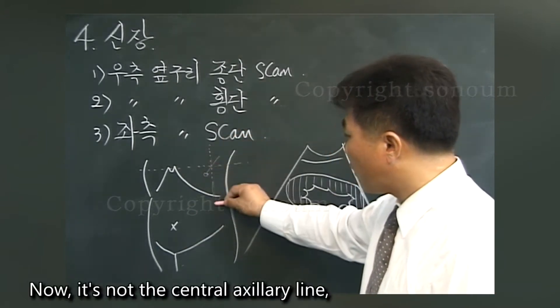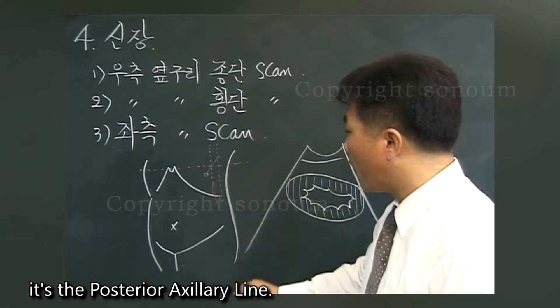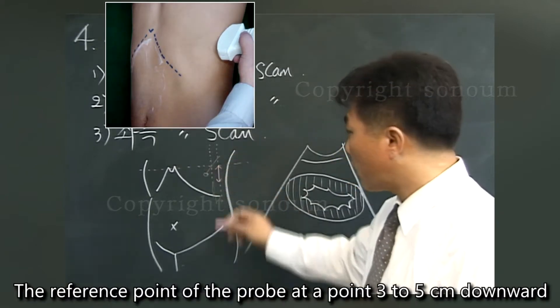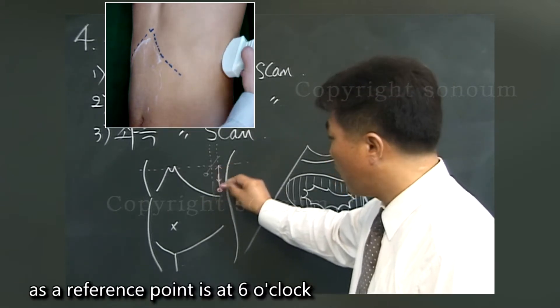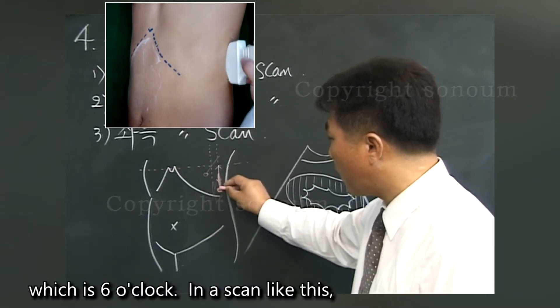It's not the central axillary line — it's the posterior axillary line. The reference point of the probe is at a point 3 to 5 centimeters downward from here. The reference point is at 6 o'clock or 7 o'clock in a scan like this.